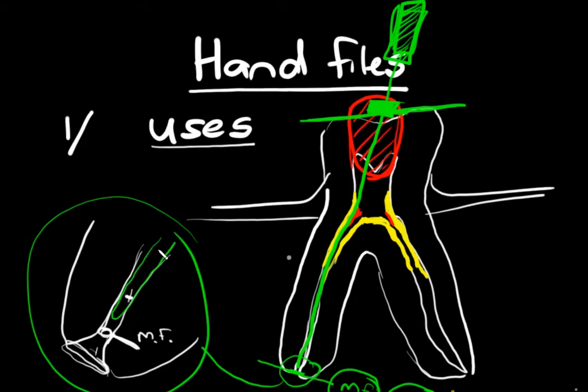How much short depends on who you talk to. And if we were just to dictate, for argument's sake, that distance there to be half a millimeter. So that's the basic anatomy anyway of the root end, and it's never that straightforward, but when you look at it in general terms, that's good enough.